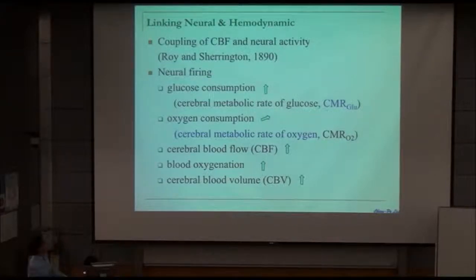What does the BOLD signal mean? It means that when there is neural firing, there are oxygen changes, cerebral blood flow changes, blood oxygen changes, and also cerebral blood volume changes. The most important issue is that, for example, when I'm talking to you, my language area is quite active and there is some oxygen consumption, but a lot of measurements tell us that the inflow of fresh blood, or oxygen level, is higher than the consumption.